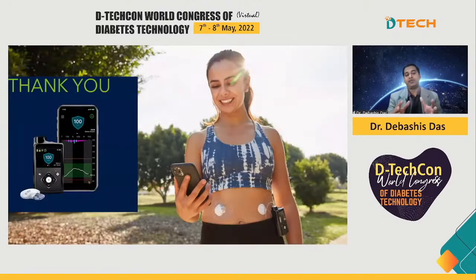So that was all in my presentation about how you decide on whom to recommend, and discuss insulin pumps, what the different criteria are, who is the right candidate, and how to give them options of the different pumps we have, depending on the cost, the clinical scenario, the education, the tech savviness, everything, and then initiate on that baseline. As I said, we just start there. Depending on the glycemic profile, we change the settings once we meet them every month, and then maybe every 3 monthly or 6 monthly. Thank you again for a patient hearing.